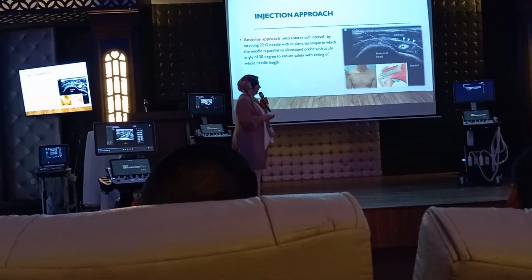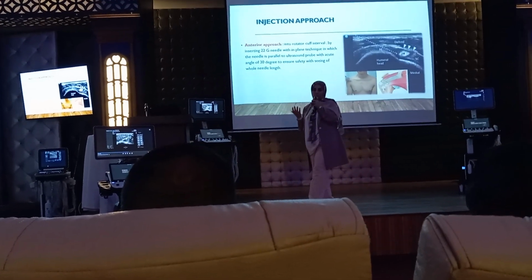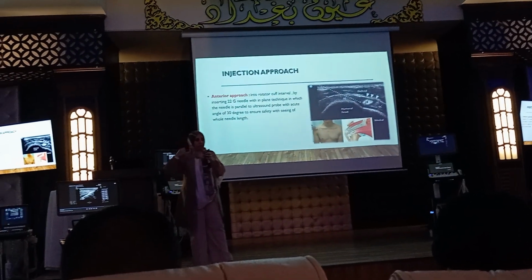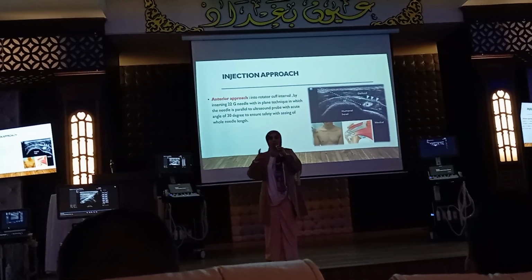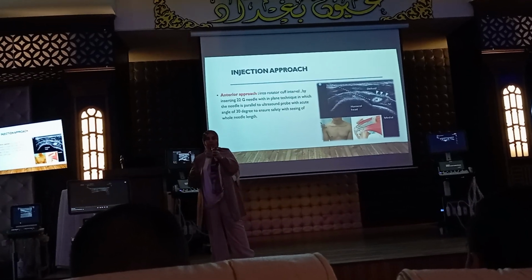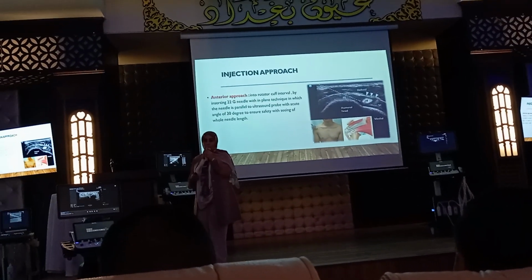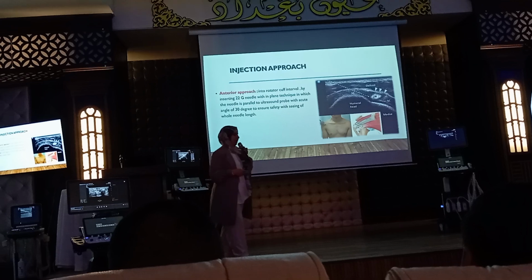So we say how to inject the shoulder joint if it is, for example, severe osteoarthritis, and there is severe limitation of movement, osteophyte, and the patient can't move his shoulder. So I need hydrodilatation of his shoulder to make more movement for his muscles, to make more space for the joint. So injection of Monovisc. What is Monovisc? Monovisc is hyaluronic acid, as we said.